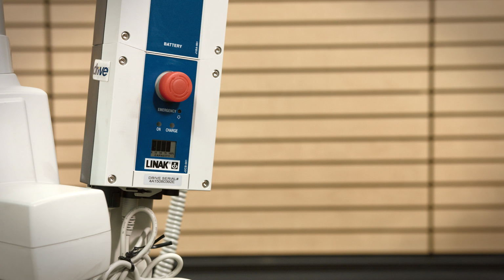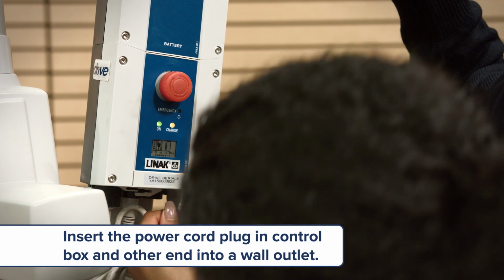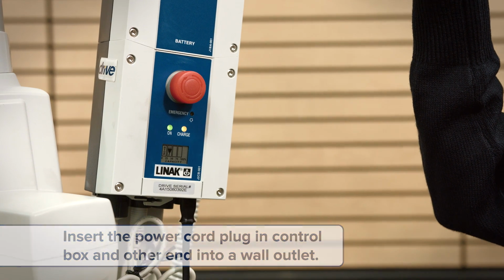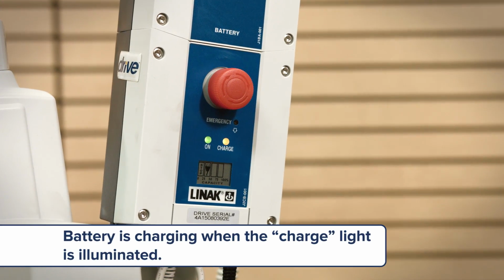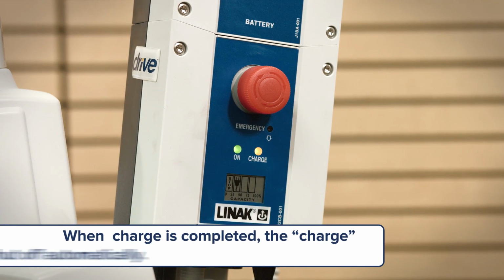Here's how to charge the battery on the bariatric patient lift. With the battery box, control box, and actuator assembled, insert the power cord plug in the control box and the other end into a wall outlet. The battery is charging when the charge light is illuminated. When the battery charge is completed, the charge light will shut off automatically.